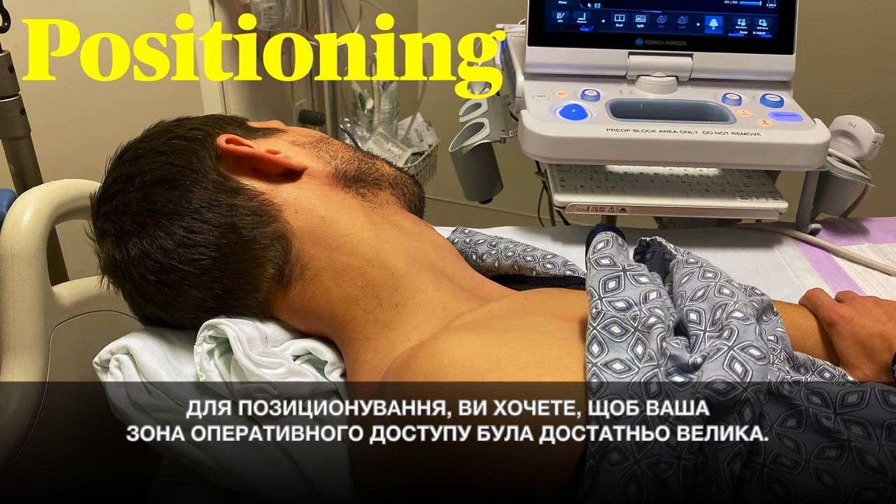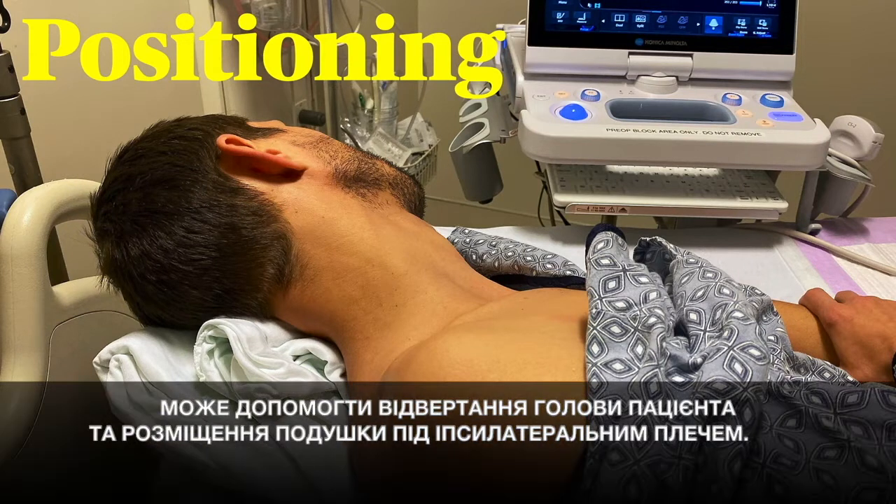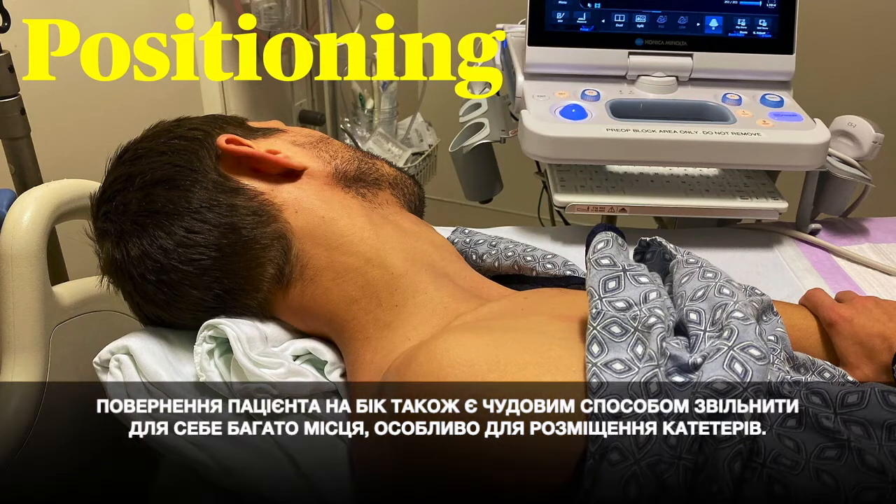For positioning, you want to have good exposure to your working area. Turning the patient's head away and placing a bump under the ipsilateral shoulder can help. Turning the patient on their side is also a great way to give yourself lots of room, especially when placing catheters.